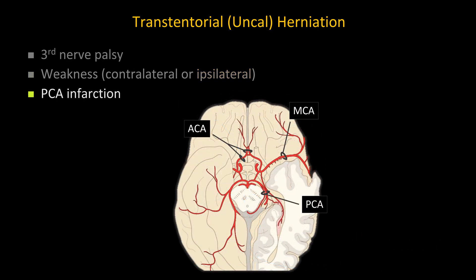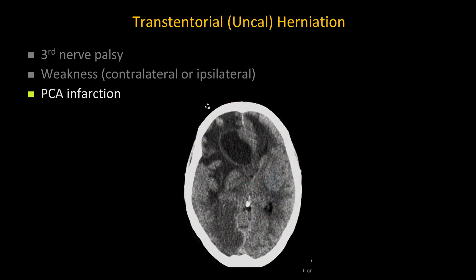Another potential complication is PCA infarction. Given the close relationship between the uncus and the adjacent PCA, uncal herniation can cause mass effect against the PCA, resulting in PCA infarction. This example shows a patient with right-sided uncal herniation causing right-sided PCA infarction.